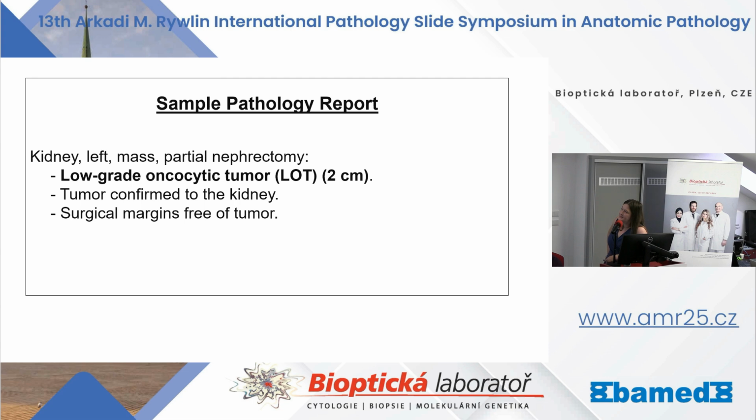And here you can see an example of how we report the cases of LOT. So low-grade oncocytic tumor, tumor confined to the kidney, and surgical margins are free of the tumor. With the comment, to date, limited data indicate LOT tends to follow an indolent behavior.